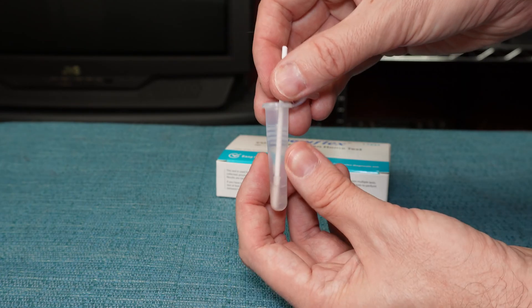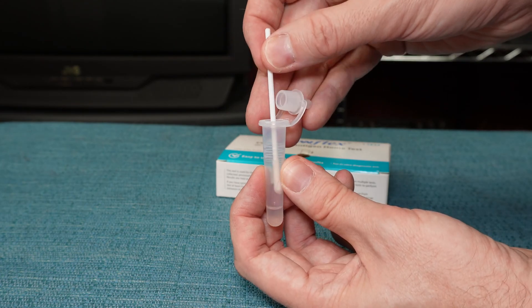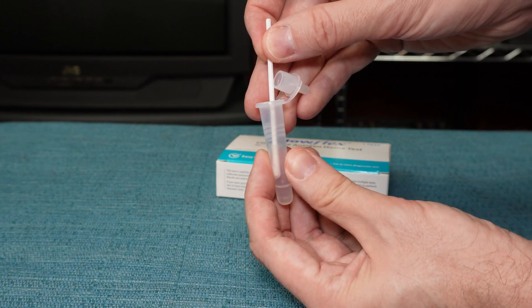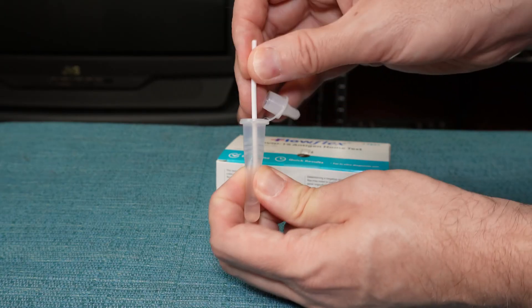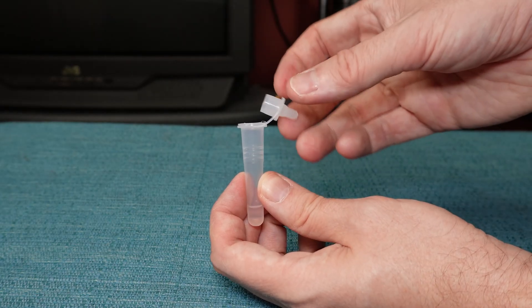Then raise the swab a little bit higher in the tube so that it's out of the liquid, and squeeze the tube around the swab to wring out any moisture that's left in it. Then go ahead and throw away the swab.